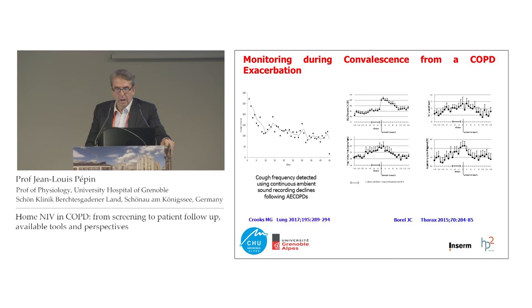It's also interesting to keep in mind that not only predicting the exacerbation is interesting, but also predicting the return to normal condition, the recovery after exacerbation. And again, you can do that very easily by using the parameters of the NIV. There are many sensors now included in telemedicine platforms to look at the improvement and the recovery after exacerbation. For example, there are cough frequency sensors that are available at home.